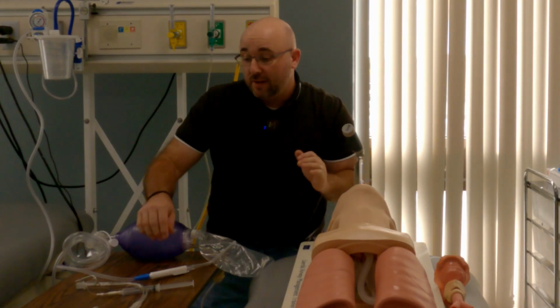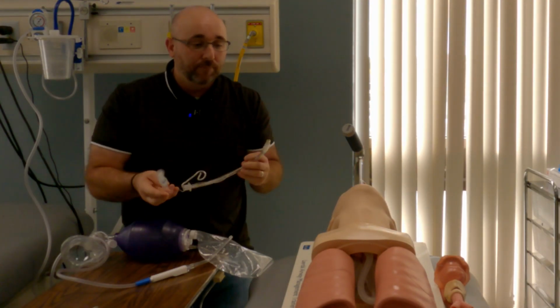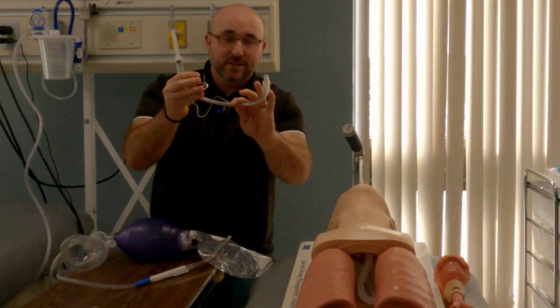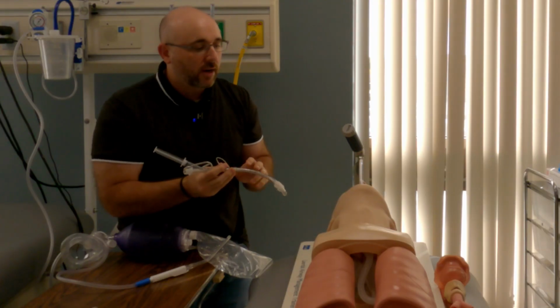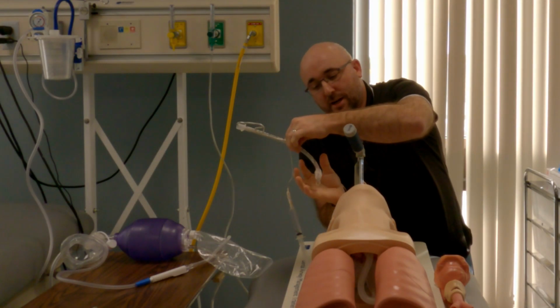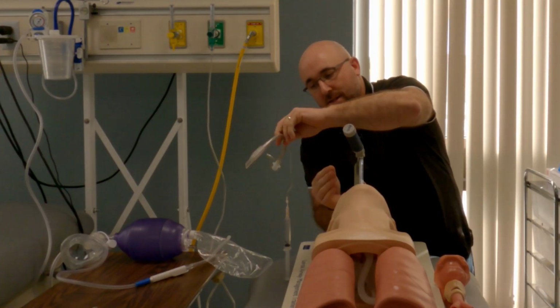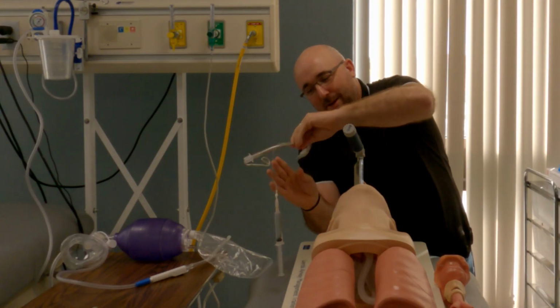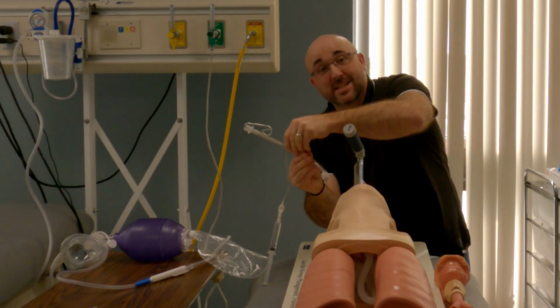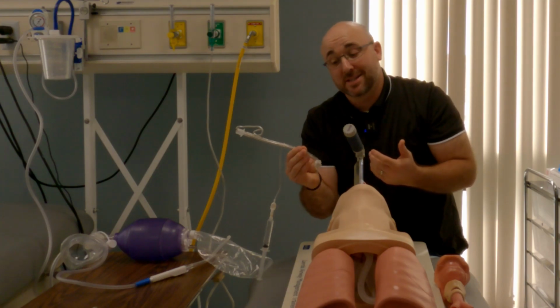Now the person on this side, when they hand the endotracheal tube, you'd pull the package off of it. You've already tested the cuff, the stylet's in, everything is good to go here. You're going to hand it to this person about like this. They're going to reach up, and you're going to hand it to them like this. Don't hand it to them like this. Don't hand it to them like this. You're going to hand it to them like they're going to insert it. That's the best way to be the best assistant you can.